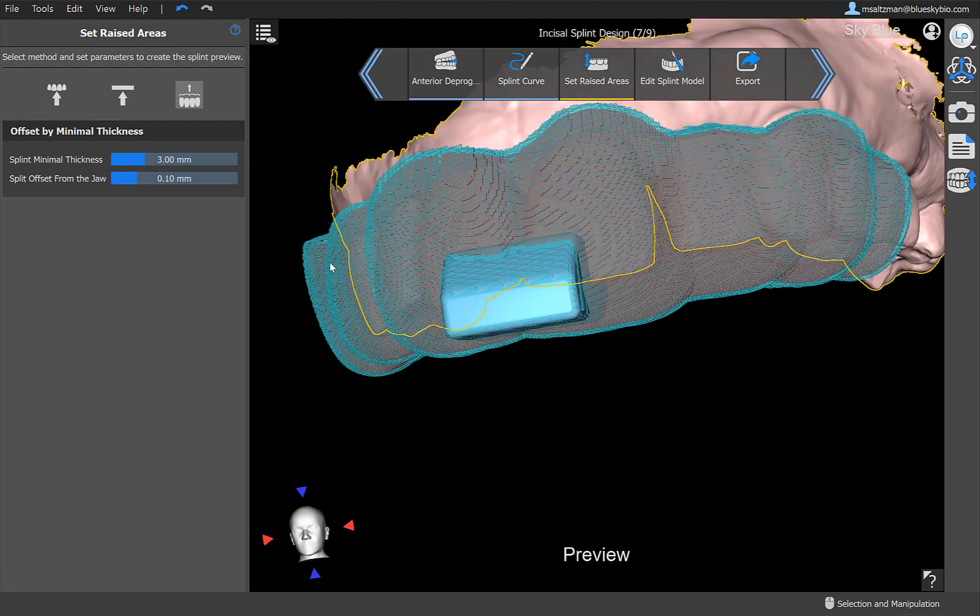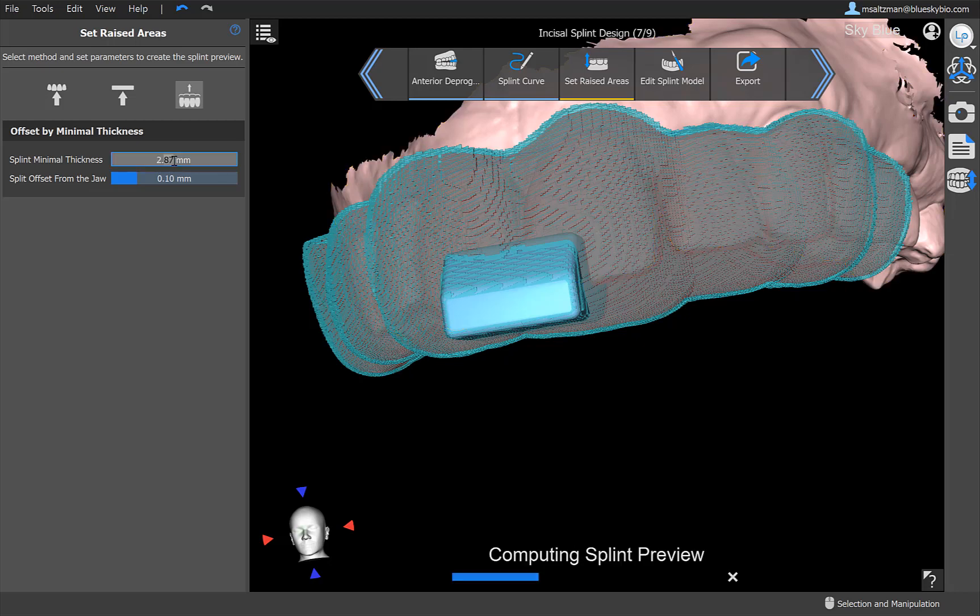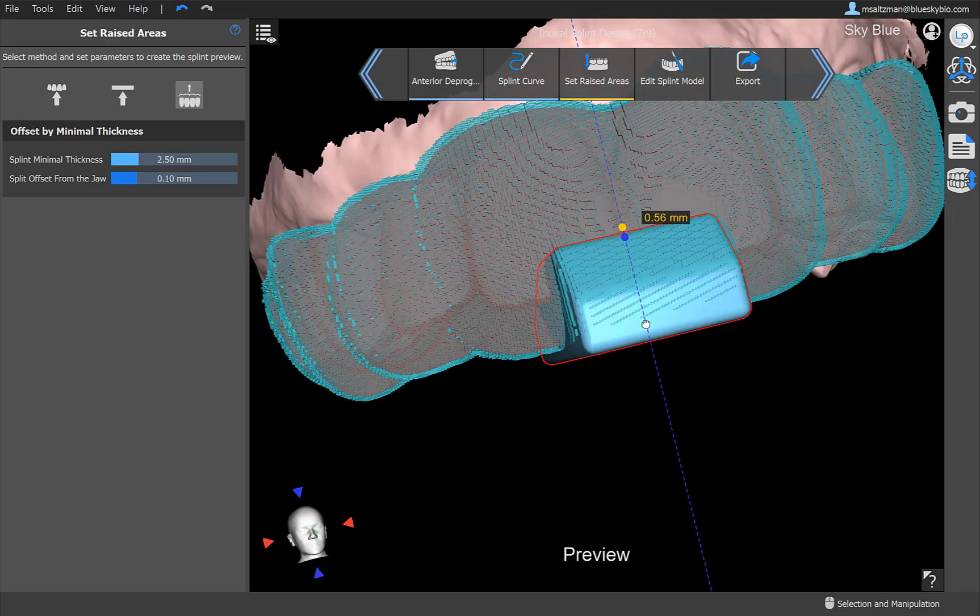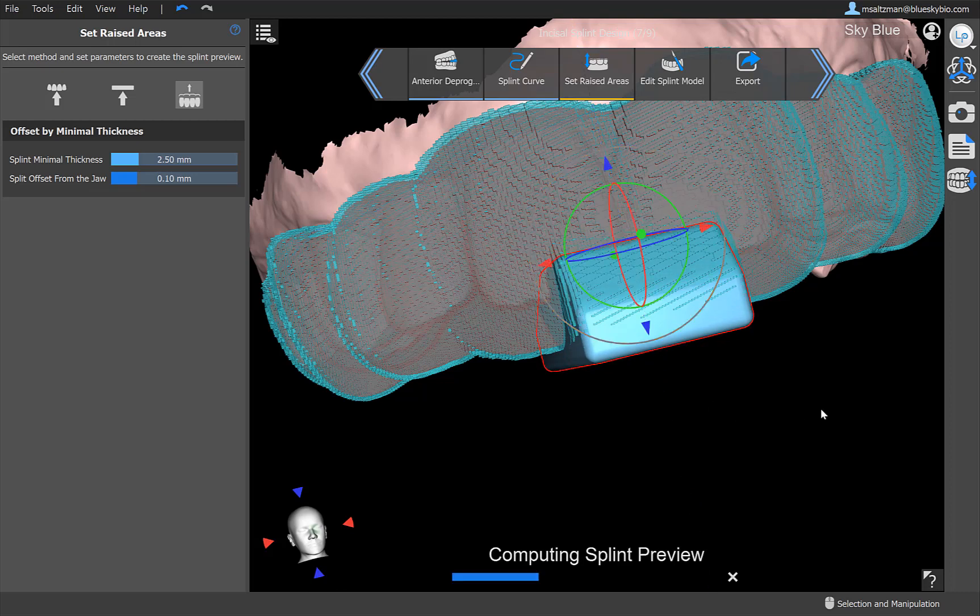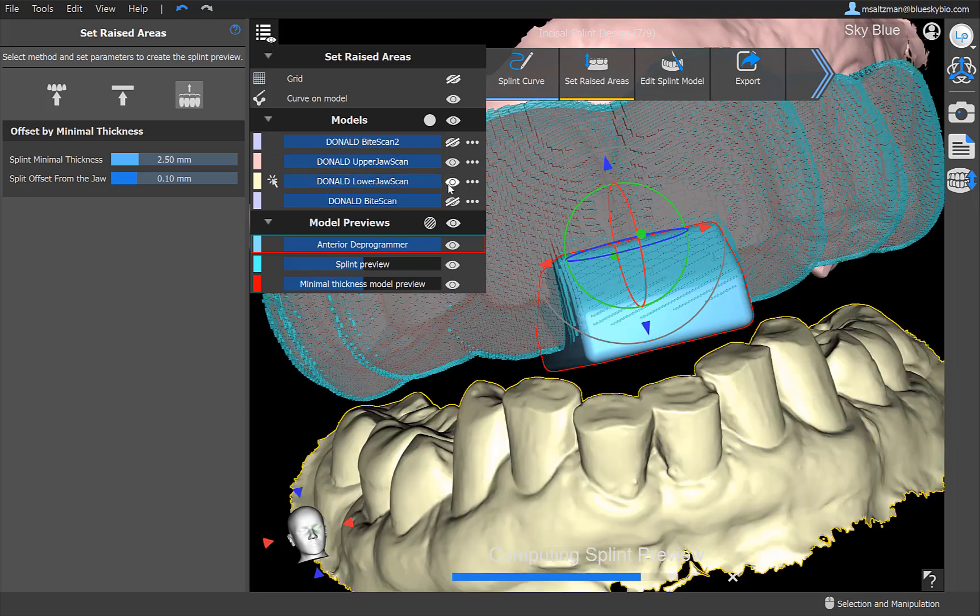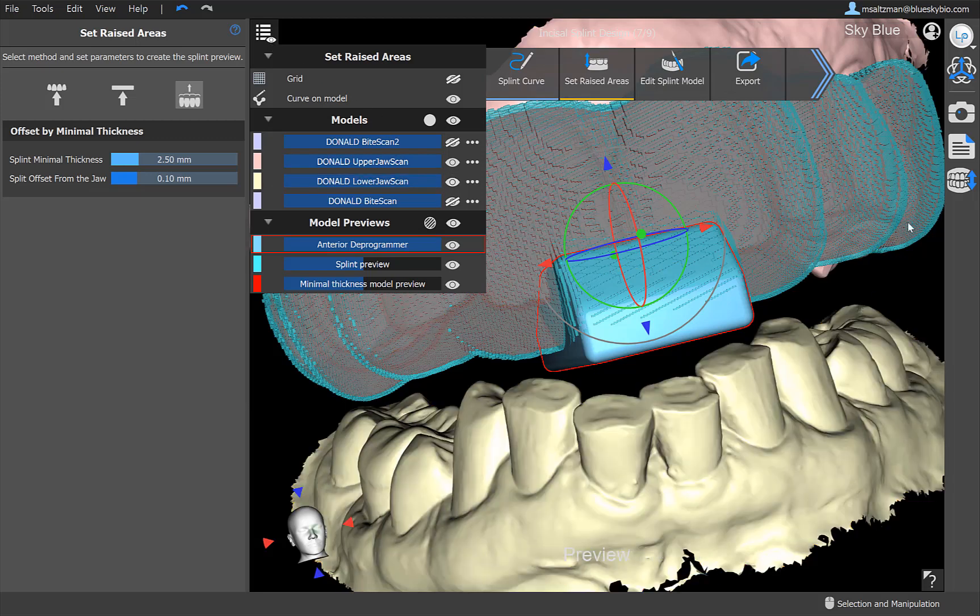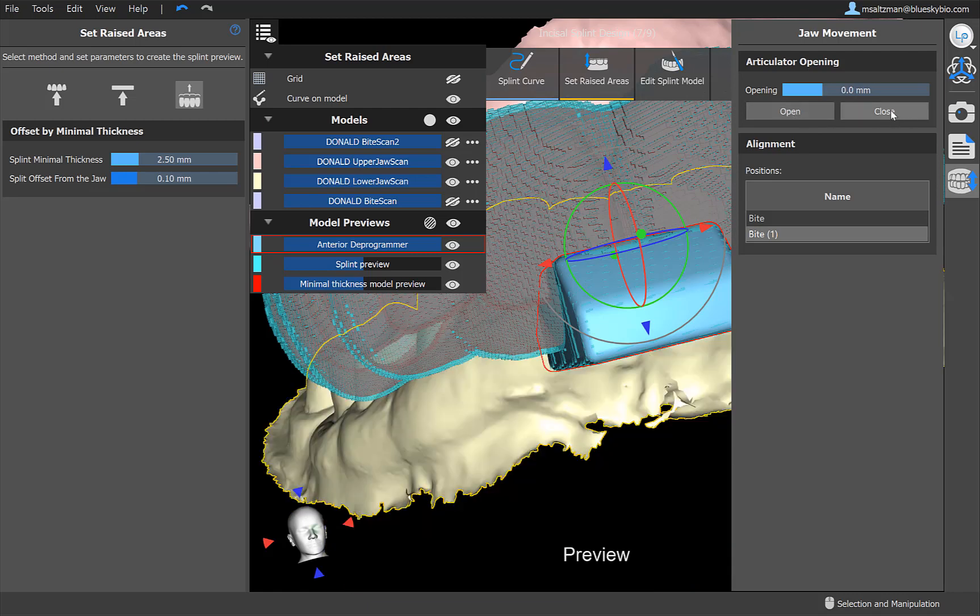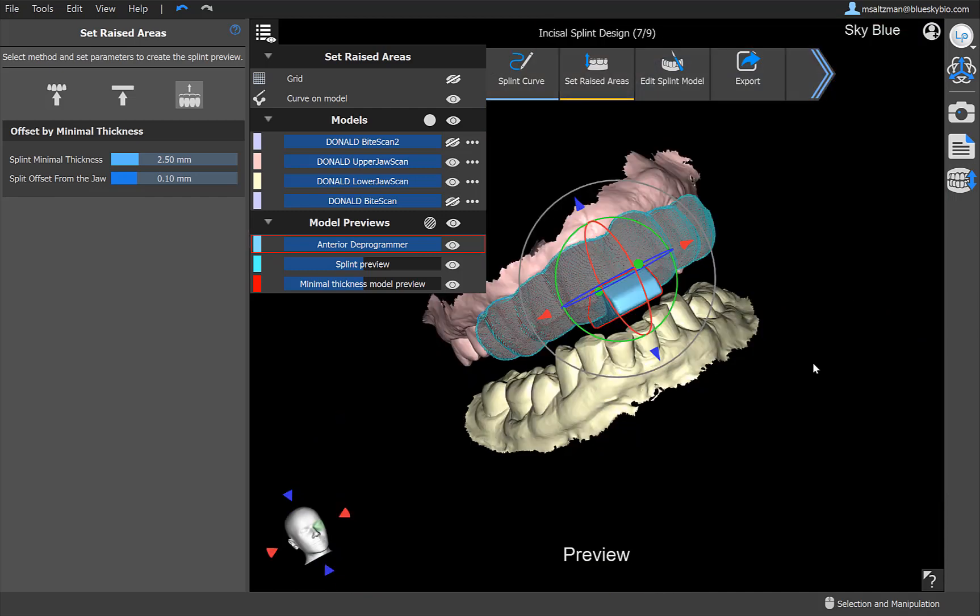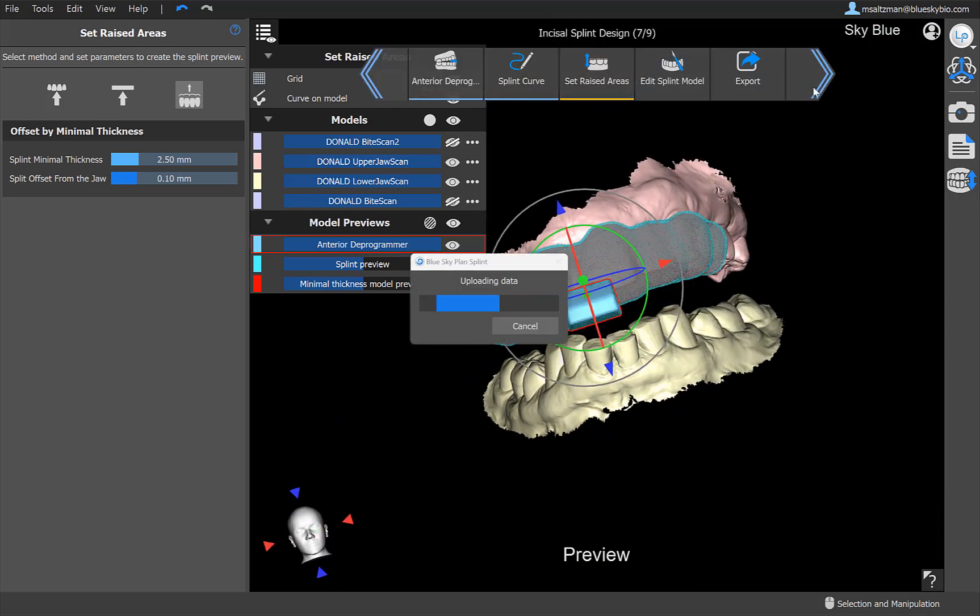Right now I'm using the functionality to raise the splint thickness to a visualized plane and I could see what my resulting splint would look like. If I want to switch and do it based on minimal thickness, I could go ahead and do that and again we're rendering a very quick preview for you so you could see how that will look. If I want to make my splint a little bit thinner, I could go ahead and drop that down to 2.5. If I want to move my anterior deprogrammer slightly, I could go ahead and do that. I could of course show my lower jaw, I could open and close that through the quick access tools that we have on the right hand side. Once I'm happy with the draft of my splint, I could go ahead and click on next.